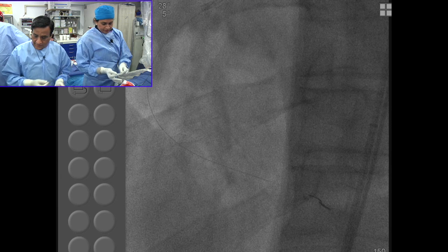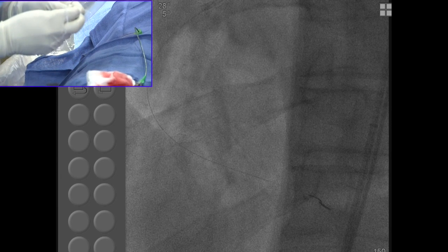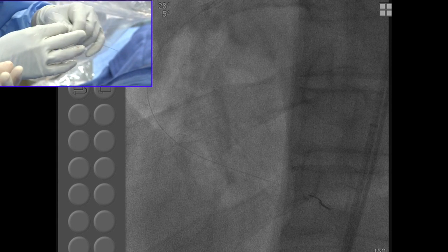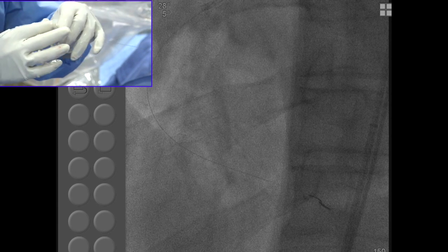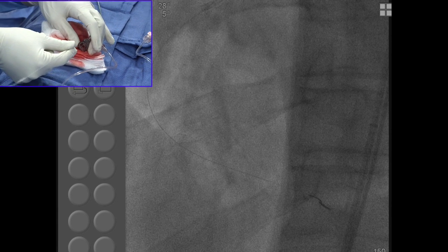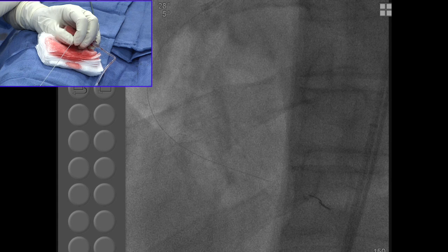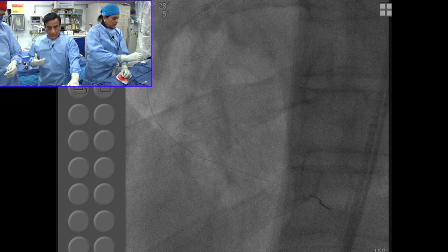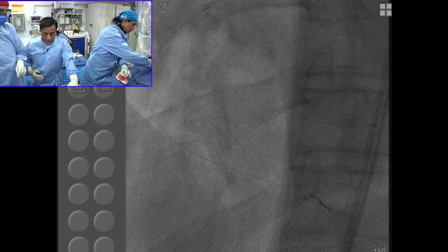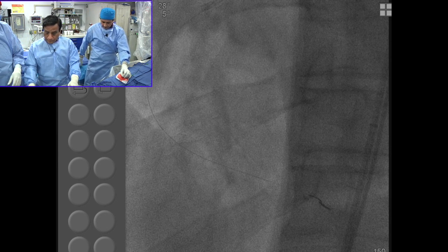Yeah, they will do better with the BVS, particularly at a young age, because the whole advantage of the BVS really comes after 3-4+ years. So maybe in a younger age group, and let's say the ABSORB 3 trial becomes positive and FDA approves it, the decision will be which case you use it in, because probably everybody will ask for the BVS stent. But we know some cases will have a difficult delivery and may create even more problems, so we'll continue to use a metal stent.